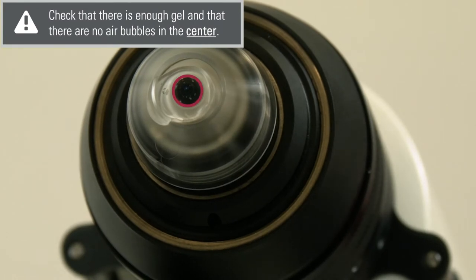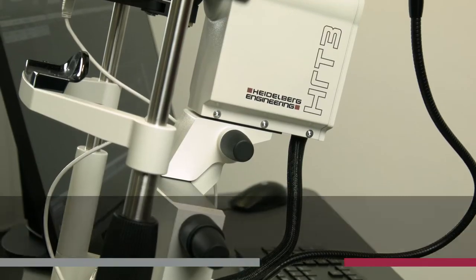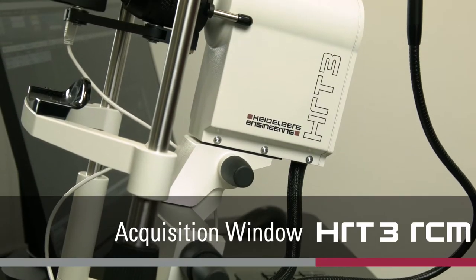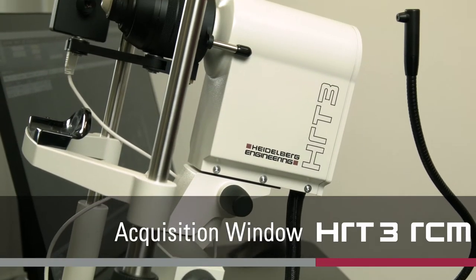Do not use ultrasonic gel or gel with low viscosity.